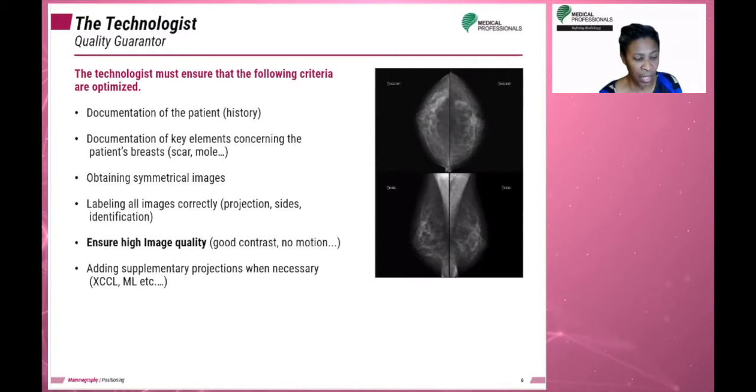So some of the surgical things that you should be checking your patients for is, did they have a needle biopsy or any type of surgery? And just be careful sometimes when you ask the patient if they had surgery, they may actually have done a biopsy, so you need to be exact. And the term lumpectomy can sometimes be confusing for patients too. They may think that a lumpectomy is any type of surgery on their breast. So in those cases, you may make sure you follow up with questions to the patient to get an exact answer.